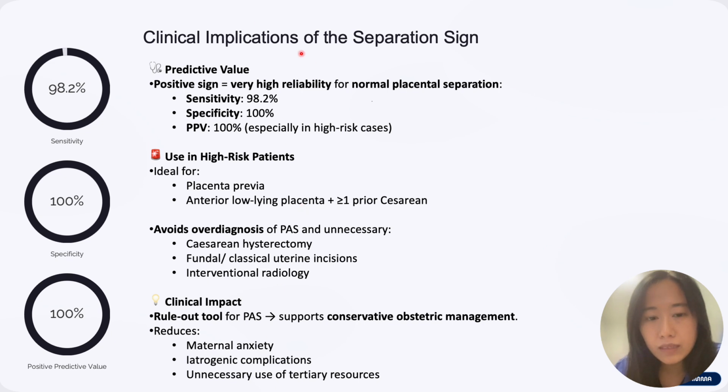So what is the clinical implication of the separation sign? Let's start with the clinical impact. It's a rule out tool for PAS. We cannot diagnose PAS with the separation sign. As we said, to diagnose PAS, it needs multiple signs. This is for ruling out.